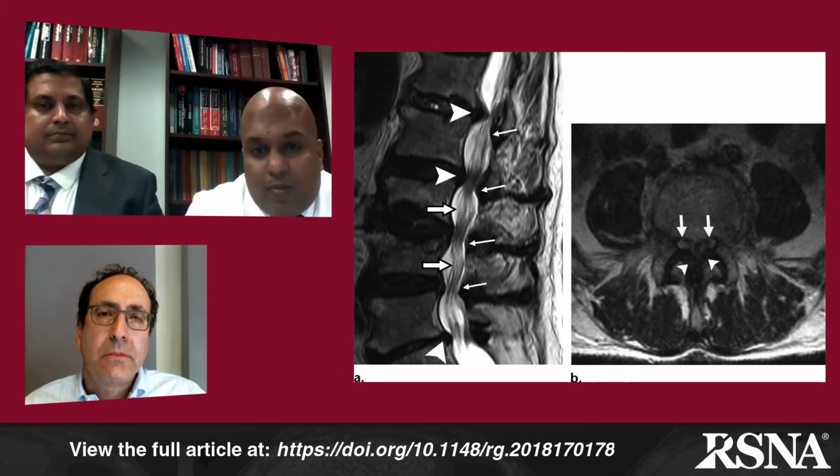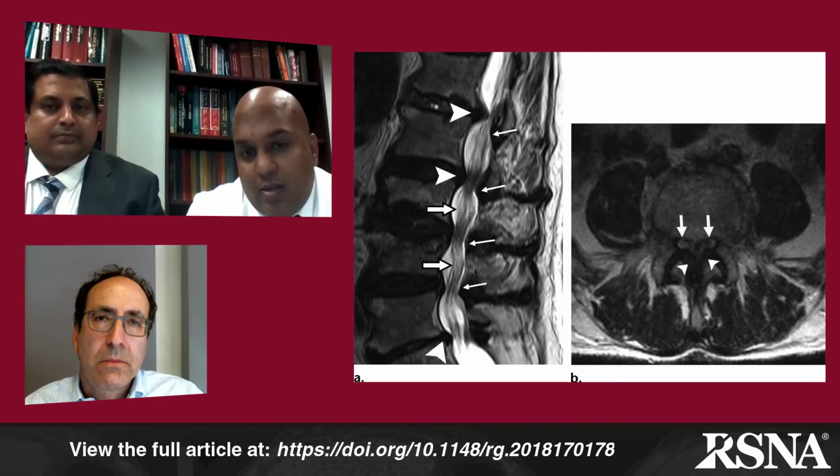These images are sagittal T2-weighted and axial T2-weighted MR images. The arrowheads demonstrate disc bulges or herniations impressing upon the ventral aspect of the thecal sac. These small arrows point to ligamentum flavum buckling or infolding, compressing the dorsal aspect of the thecal sac, creating an hourglass appearance. And the white arrows anteriorly show a redundant or serpiginous appearance of the cauda equina.